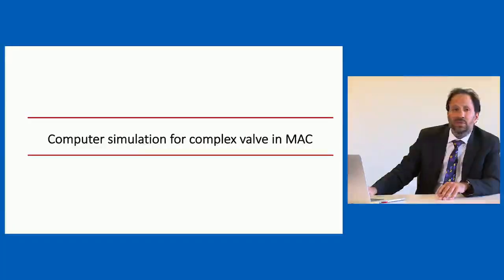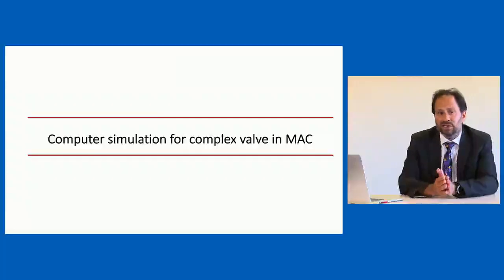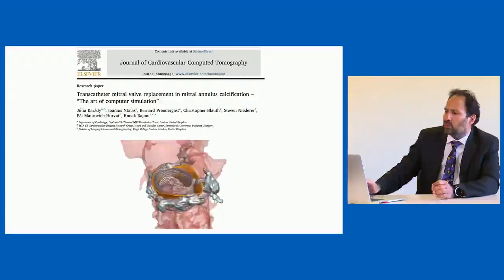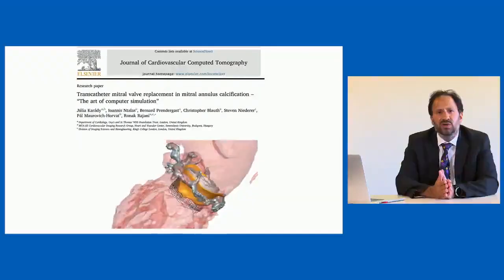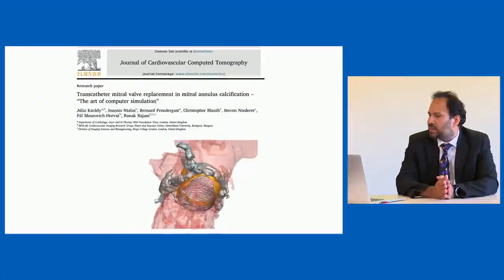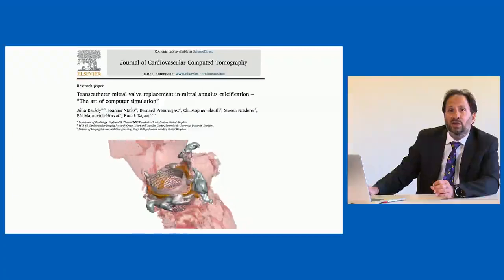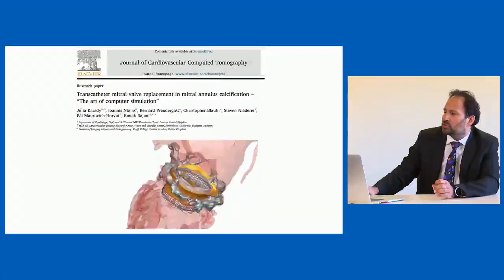Other techniques also exist to refine our planning for transcatheter mitral valve interventions. One of the key areas of concern are patients who have mitral valve annulus calcification, and how we can improve outcomes for these patients. Fortunately, we're also able to incorporate computer simulation for these specific types of patients. This work is conducted in conjunction with our collaborators FEops in Belgium.